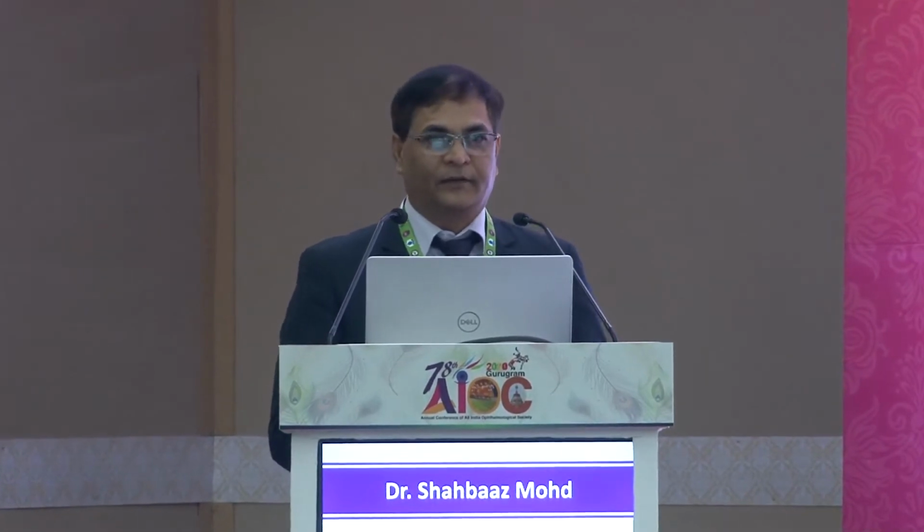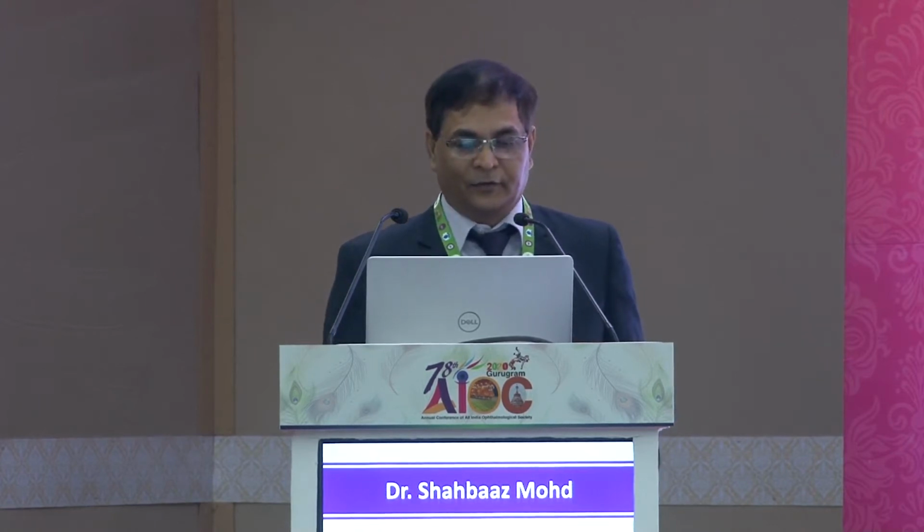As we all know, freedom from glasses after cataract surgery or cataract refractive surgery is a newer term, and we are all bound to give 100% to the patients. So the first thing in giving 100% to the patient is the correct IOL power, and for correct IOL power, the first thing is to do a correct A scan. So I will be talking just the basics about the A scan.